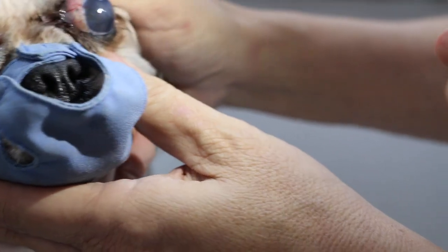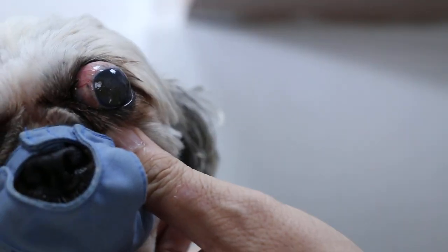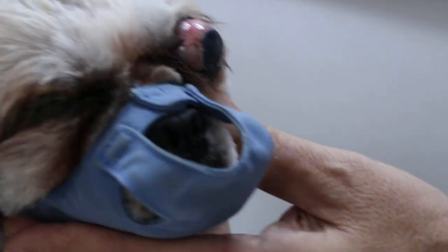Compared to this eye — this eye has an old scar. You can see your ulcer, but it will not recover already. So I will just use a fluorescein stain and check for any ulcer.